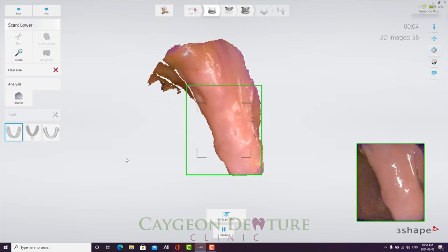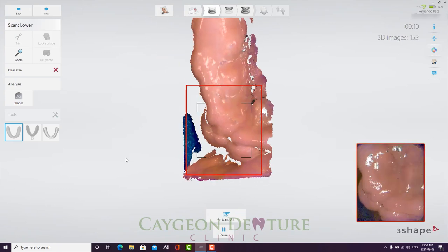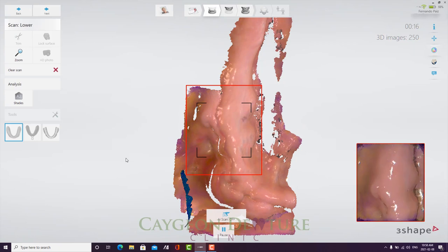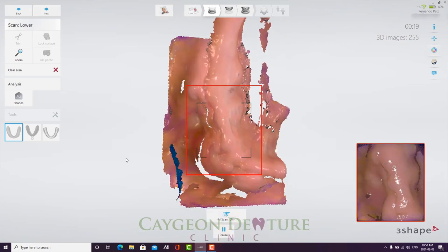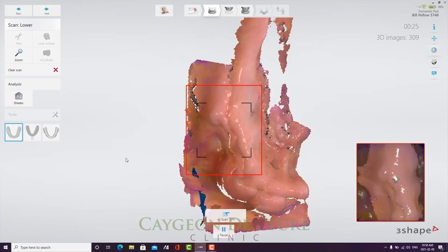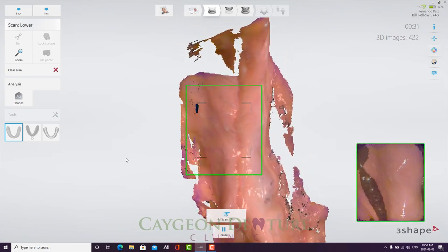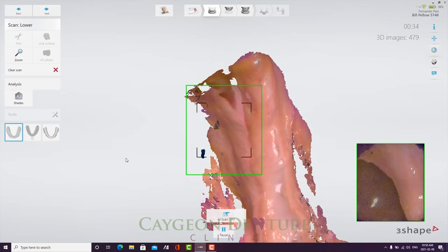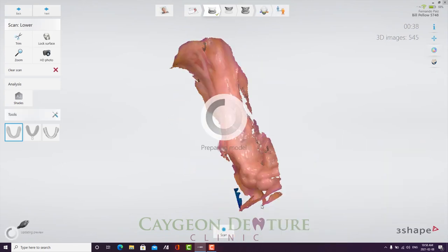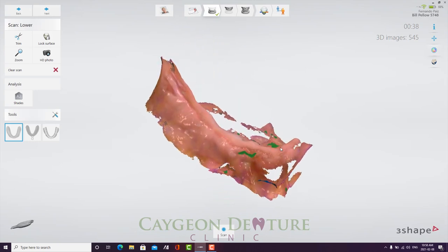This patient had extractions done 4 weeks ago and now it's on its way to healing. As you can see, there's quite a bit of detail for the scan to pick up, so it was a lot easier for me to scan this lower jaw. I do find that in order to scan the lower jaw better, the scanning tip needs to be at a certain height from the tissue, and I'm not sure why that is the case. The higher I go, the less the scanner sees. But the lower I go towards the tissue, the more it can recognize. So I am not sure if I'm doing something wrong or if there's something wrong with the scanner. So hopefully some of you that have more experience with scanning edentulous patients can shed some light on this.